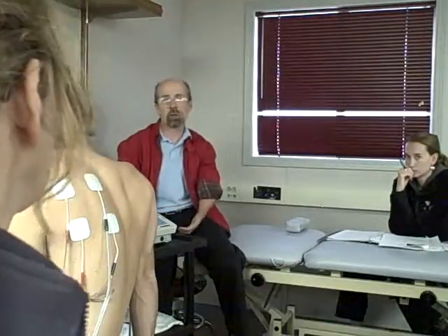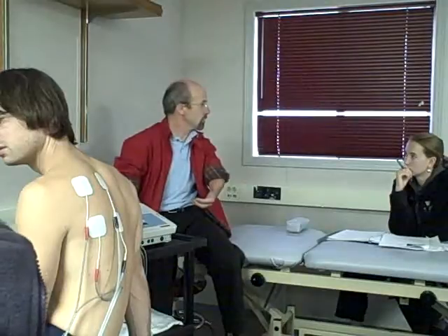Remember, the only reason you hit balance was because the patient's giving you feedback that says, I'm not just feeling a buzz. So what's the purpose of changing the channel intensity? I mean, what is the reason for doing it? It could be protocol driven. Maybe you attended a workshop, read something, heard something. Maybe it's just one more ability for you to subjectively give the patient what they want. Maybe the balance feature didn't quite address the issue. So you think, okay, let's go ahead and change the individual intensity of channel 1 and see if that helps.